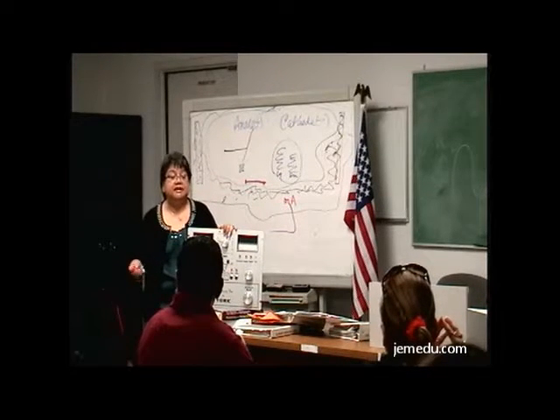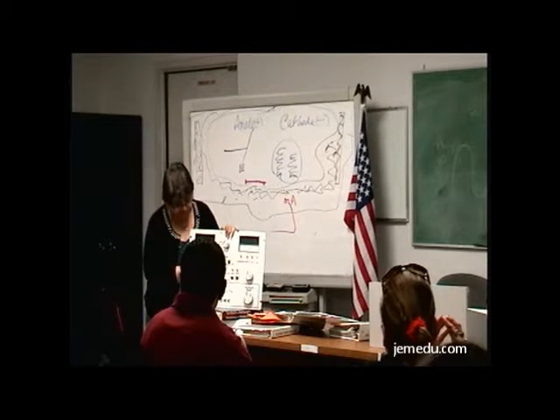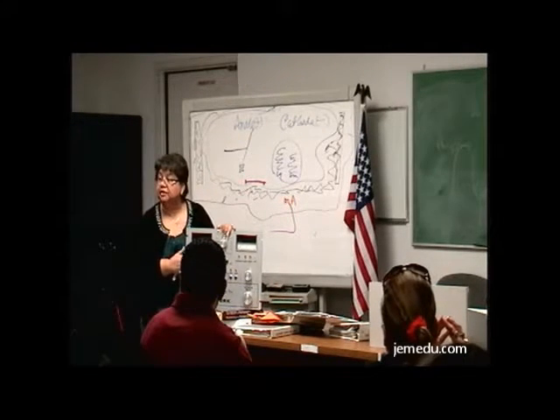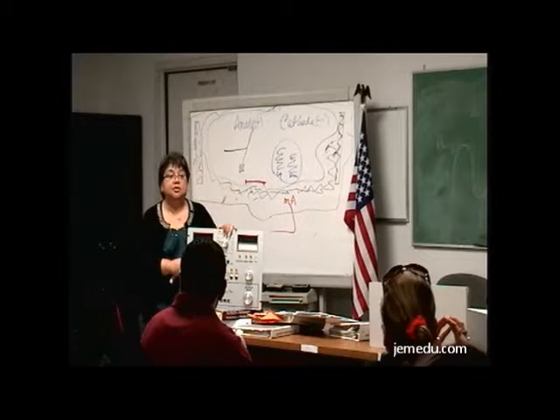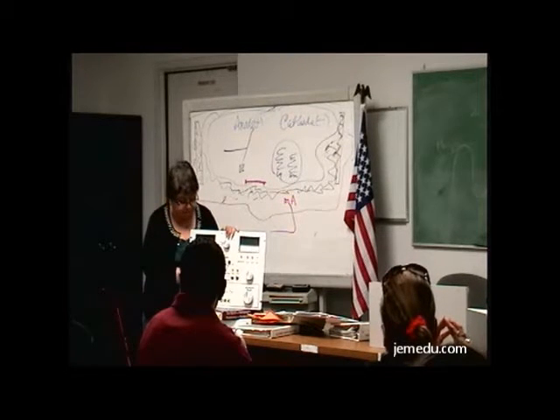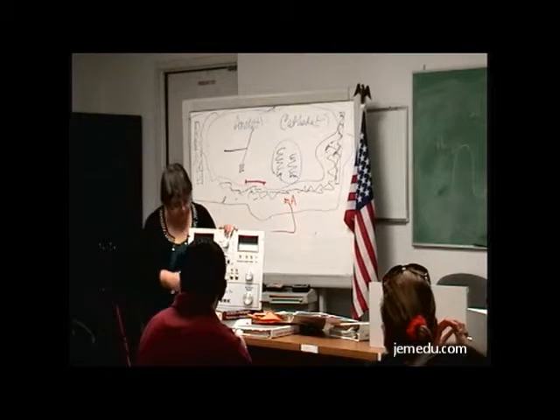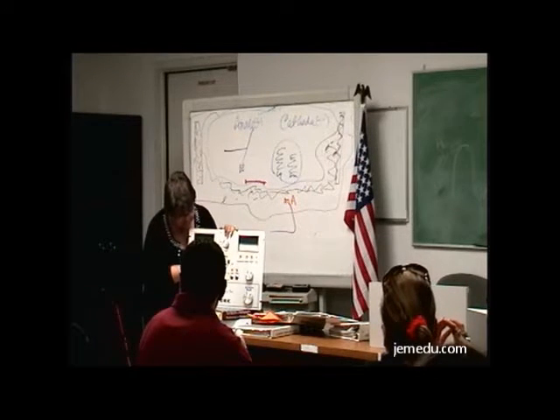If I'm using a hand or a foot or an ankle, I should be on the small, and I should be on your lower selectors, okay? If I'm doing a lumbar spine or a chest or a pelvis, I might be on the higher end, or one less even for the chest. You have to look how big your chest is, but lateral lumbar spine, you know where I'm going, right? So that's going to help you.